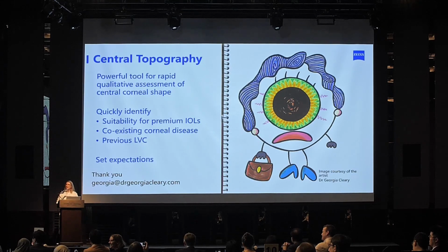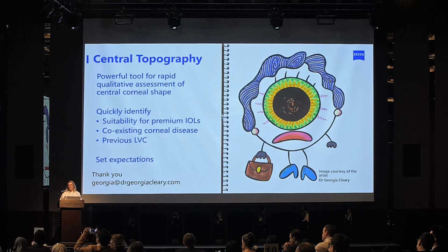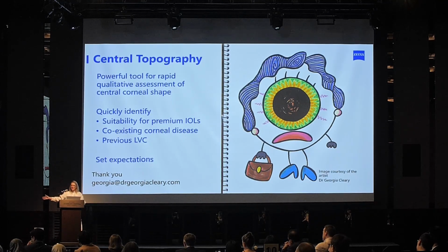Just one question for you. How often do you have to use full-size cornea topography on top of your IOLMaster? All of my patients have the full corneal topography, so they come along for their cataract assessment and have IOLMaster, Pentacam or Sirius, depending on the practice, and their macular and retinal nerve fiber layer OCT. So it's a long appointment, and I do look at both in all of them.